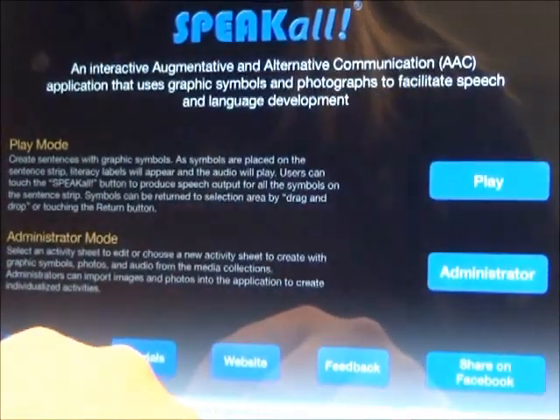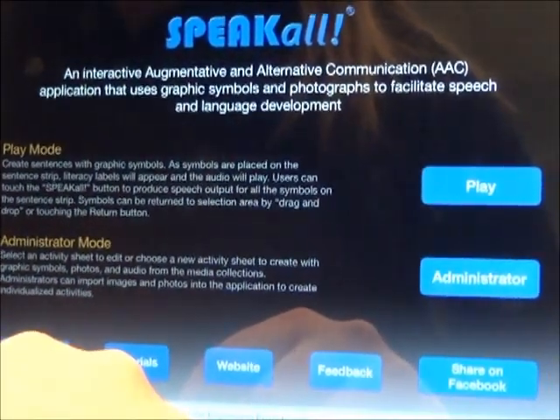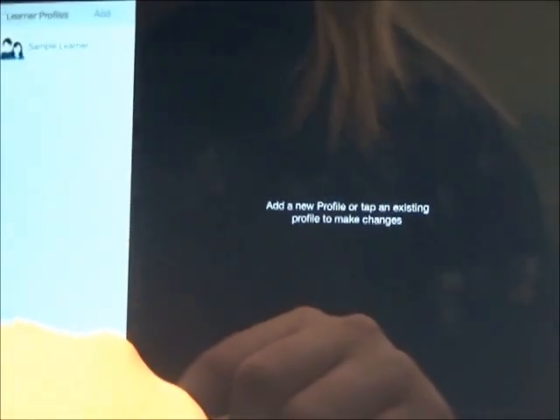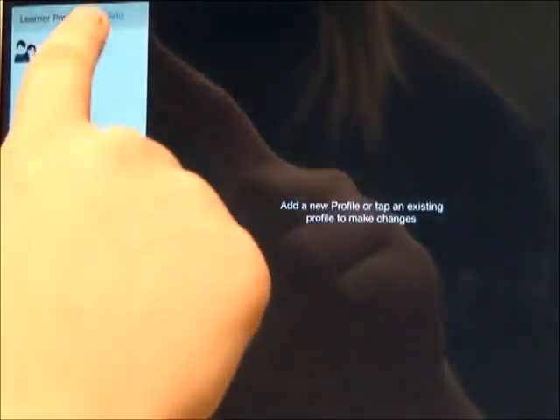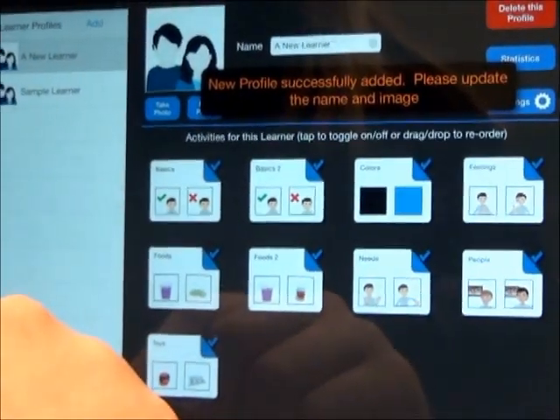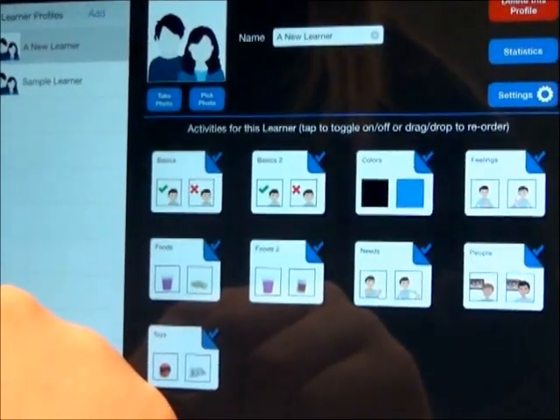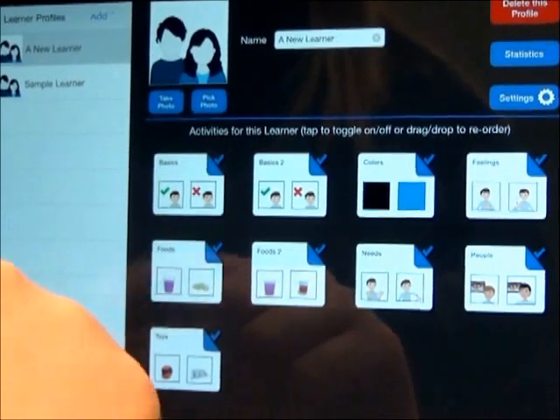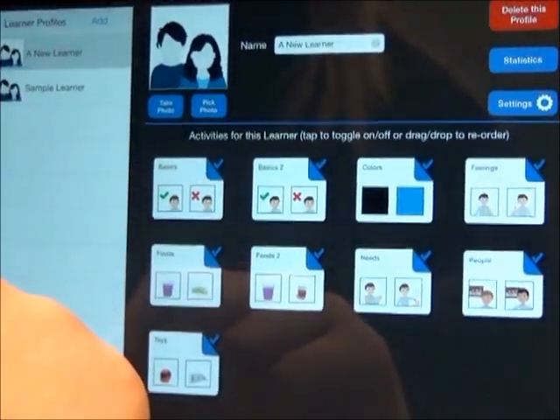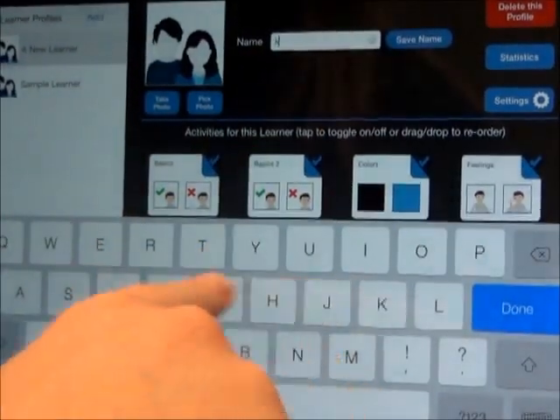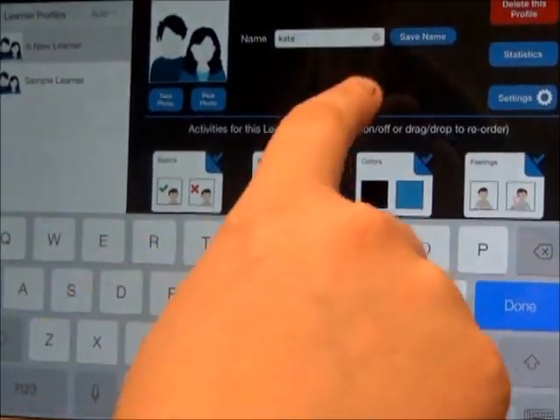To enter a learner profile, select Administrator on the home page. Then, in the bottom right-hand corner, select Learner Profiles. With the premium version, you may select the Add button, in which a new profile for a new learner will appear. To edit a learner profile, select the learner profile you'd like to edit. Then you may edit the name and select Save Name.